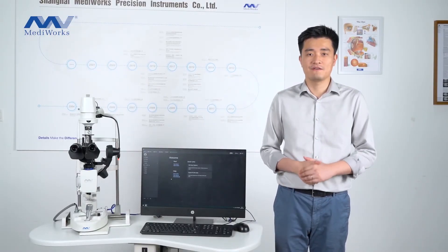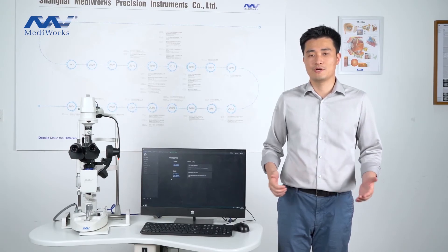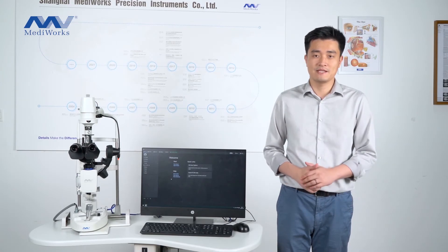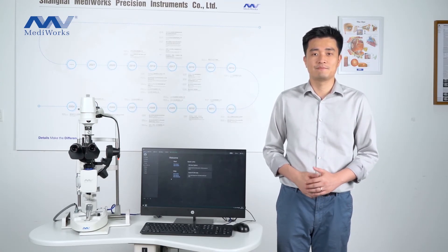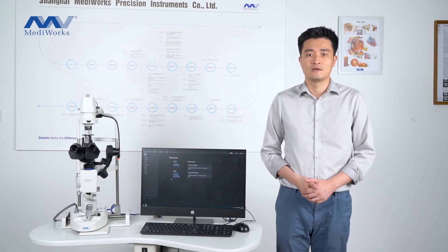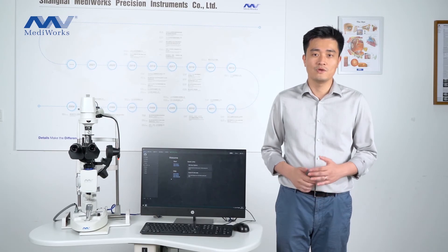Both the dry eye functions and the digital slit lamp functions are all operated in Medivir software. Medivir software also supports telemedicine and DICOM connection, and the patient information can be shared to other computers which have Medivir software installed. Medivir software is very user-friendly, and we believe that when you use it, you will like it.